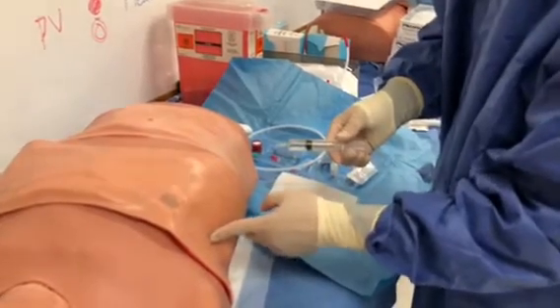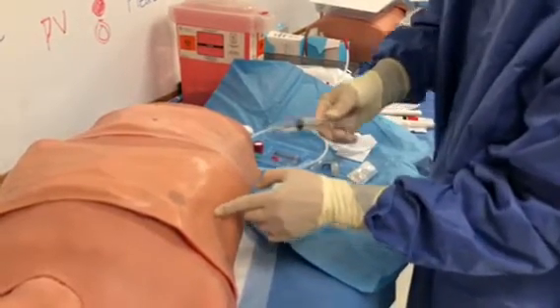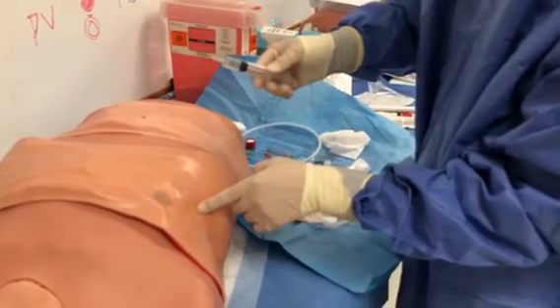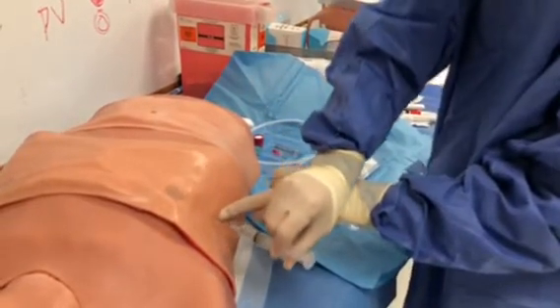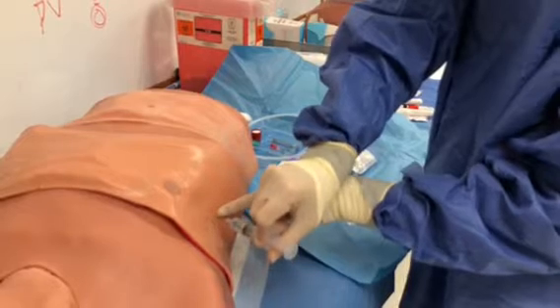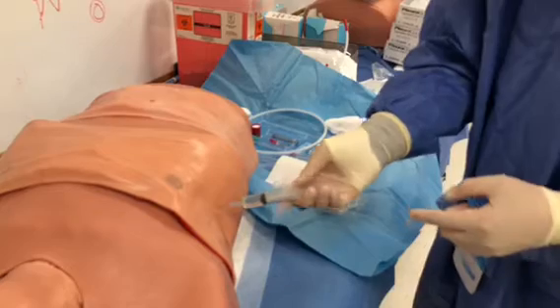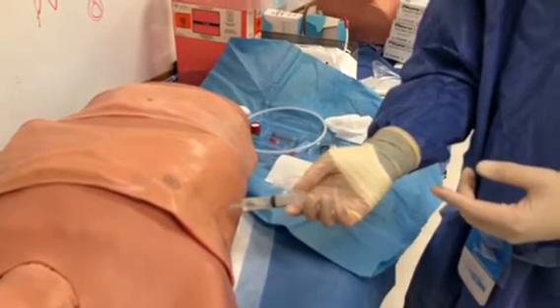If I were to go into this space, I feel the rib — the ribs run in this direction. Going a little more anterior would be slightly inferior to the inframammary fold. I go in at a slight downward angle toward the rib, then march above it and enter into the intercostal space. Once there, you can aspirate, and if you get air or fluid, you know you're in the right space.